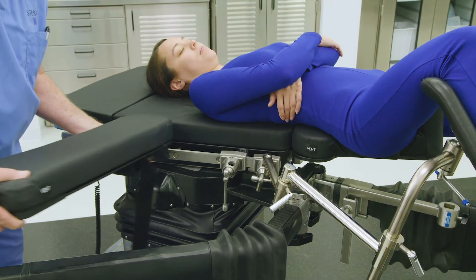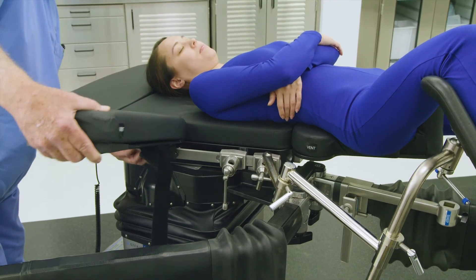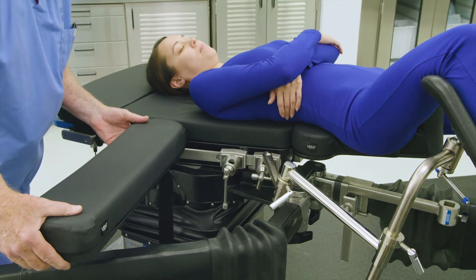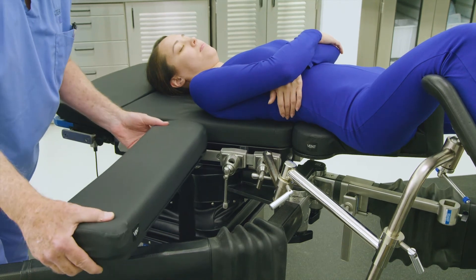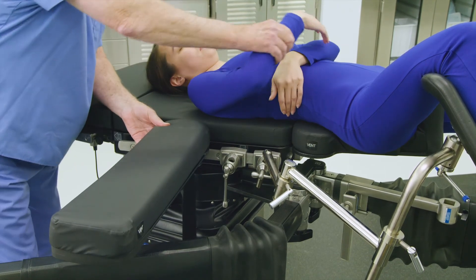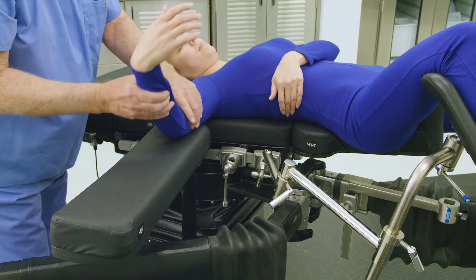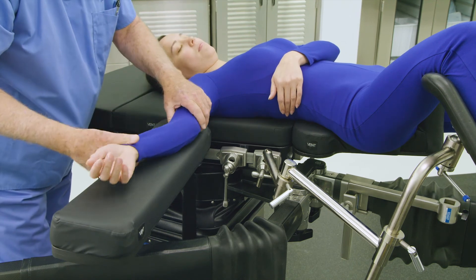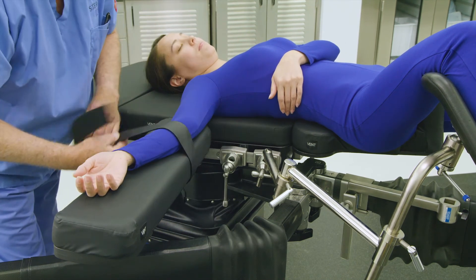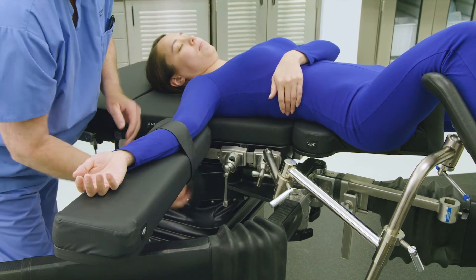Next, apply the standard anesthesia arm board to the side rail of the table on the non-operative side. Adjust as needed to accommodate proper arm position. Apply the safety strap to secure the arm.